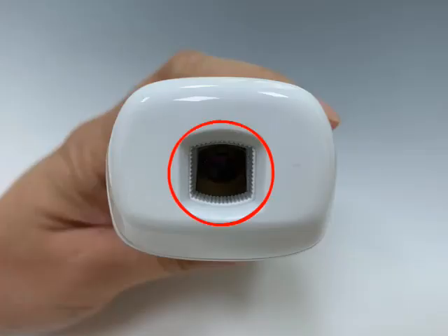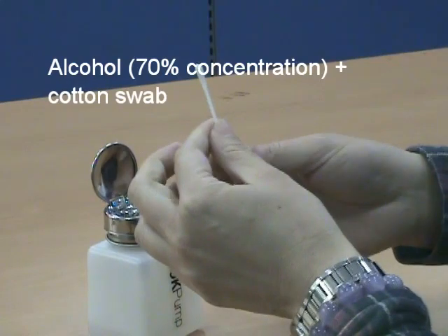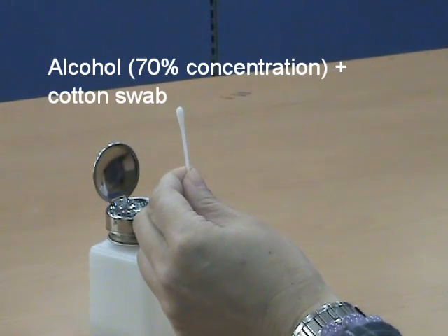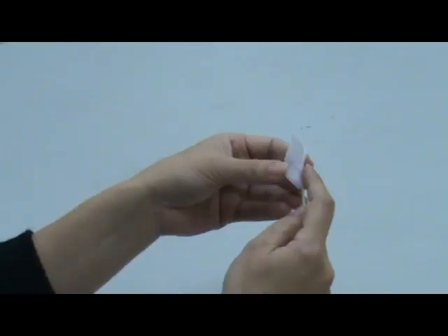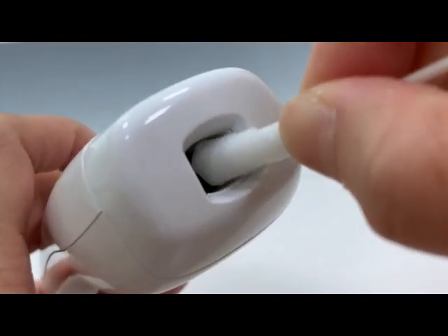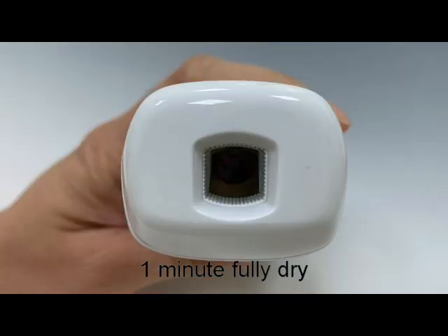Please make sure the probe is clean to ensure an accurate reading. The probe lens is the most delicate part of the thermometer — use care when cleaning to avoid damage. Use a cotton swab with 70% concentration alcohol to clean the probe. Lightly dab the cotton swab to remove excess alcohol. If 70% alcohol is unavailable, use an alcohol prep pad to moisten the cotton swab. Do not use a sharp object to wipe the lens. Allow the probe to fully dry for at least 1 minute.